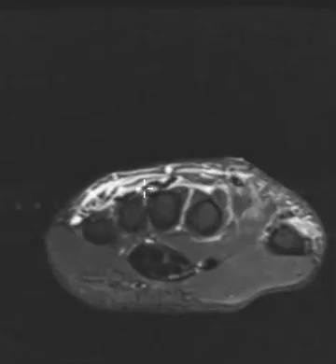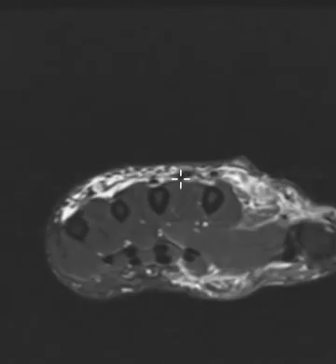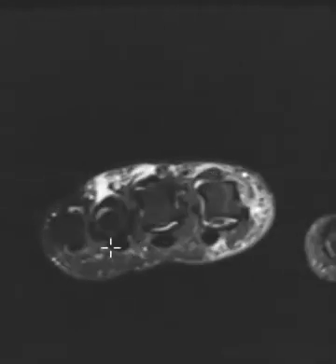If we go here to the wrist we can see the extensor tendons. If we go more distally, we're going to follow these extensor tendons up — especially looking for the one going to the second digit here. This is the second metacarpal bone. Following this up, we can see that the extensor tendons are intact. There's no extensor tendon tear, and the flexor tendons are intact as well.